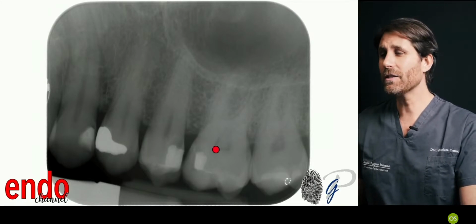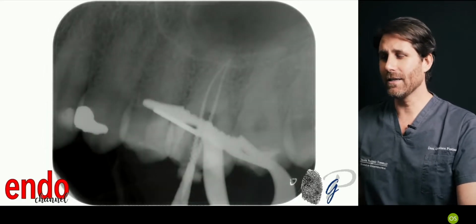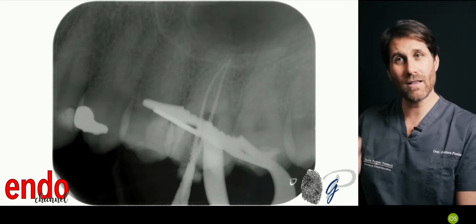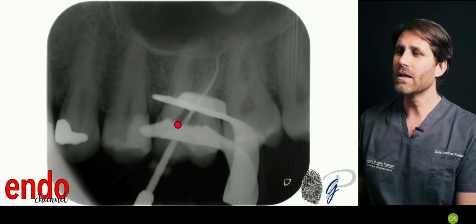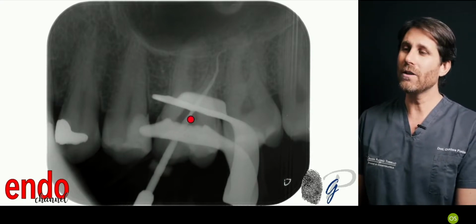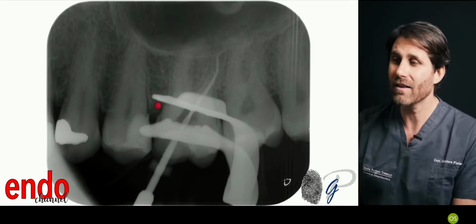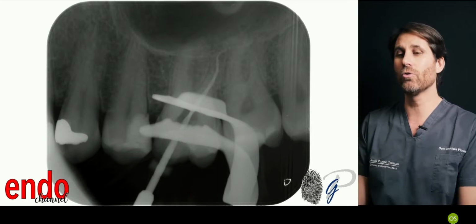As you can see, first upper molar, decayed restoration, mesial access. With this mesial access we can treat the most difficult root, the mesial root and the two mesiobuccal canals, because we have a straight line access there, and then we have a straight line access to the distal canal, because the orientation of the orifice of this distal canal you can follow through the trajectory of this instrument, and we can follow this curvature and treat the double apical curvature with performant instruments, because we are in a straight line from here. We don't need to go in perpendicularly to the occlusal surface.